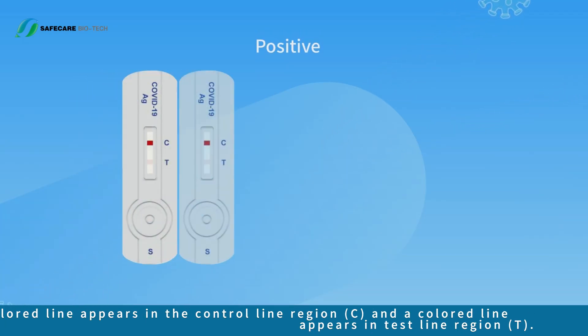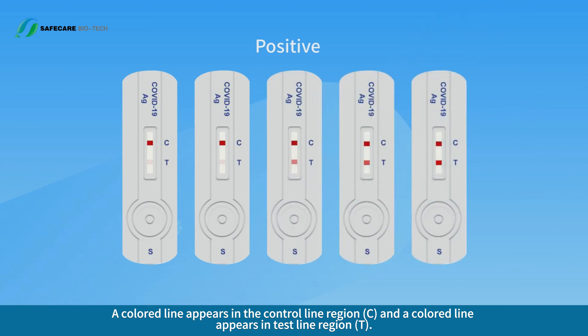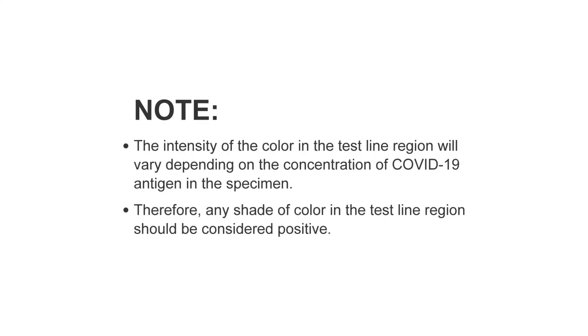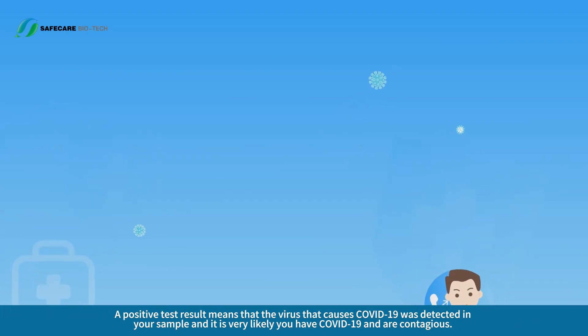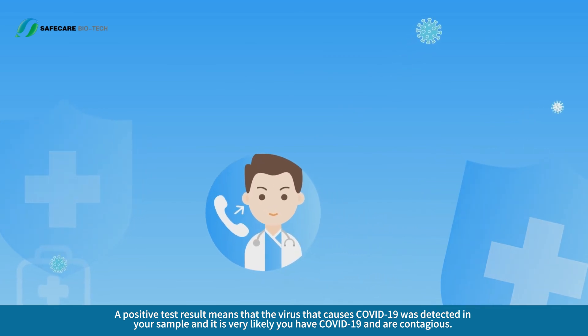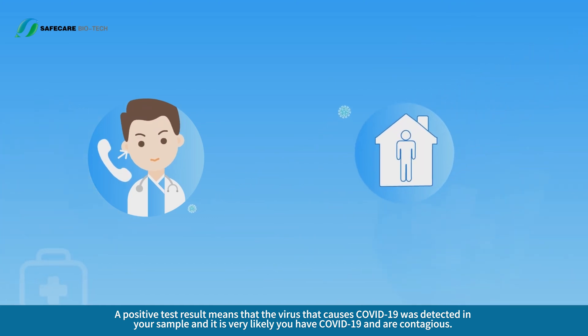Interpretation of Result — Positive Result. A colored line appears in the control line region C and a colored line appears in the test line region T. The intensity of the color in the test line region will vary depending on the concentration of COVID-19 antigen in the specimen. Therefore, any shade of color in the test line region should be considered positive. A positive test result means that the virus that causes COVID-19 was detected in your sample, and it is very likely you have COVID-19 and are contagious.